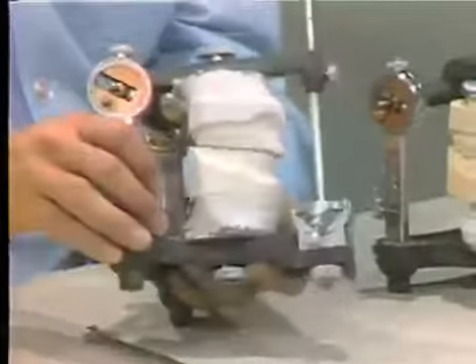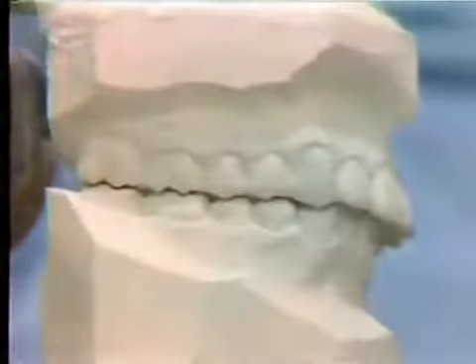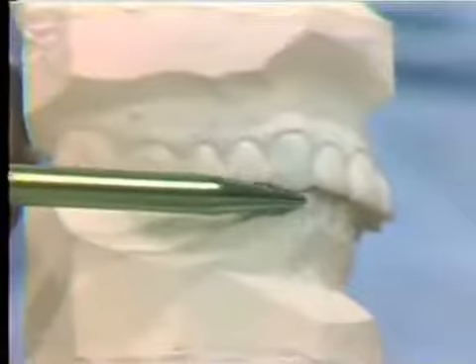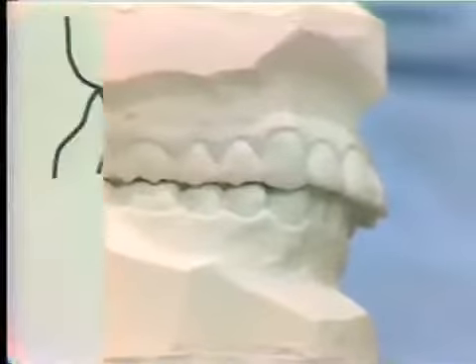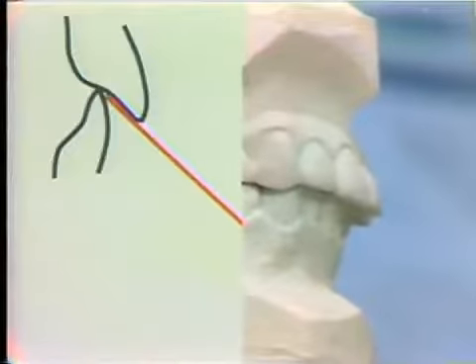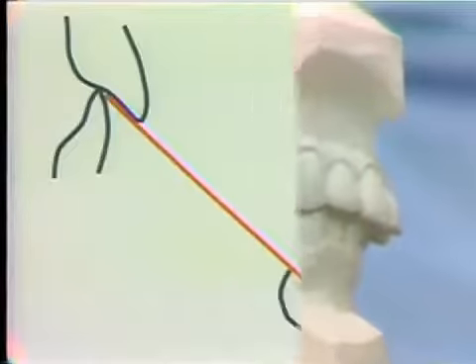We may have a case such as this, where the relation of the incisal edge of the lower incisors to the lingual surface of the maxillary teeth is a shallow angle. This can be accepted probably very nicely by the articulator.